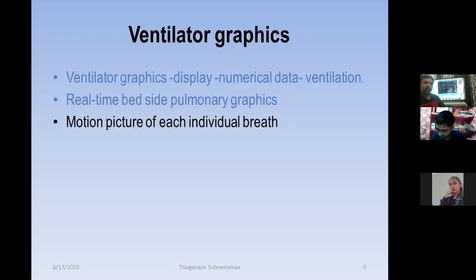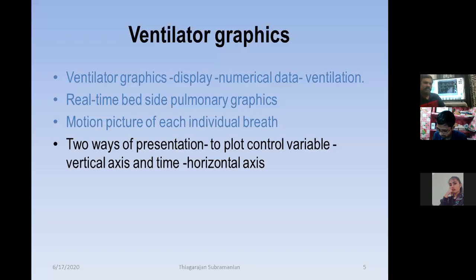Okay, these are the two loop graphs. So these are all the graph plots. Usually we see the loop graph as well as the scalar graph. These are the two major things we should always remember. I will explain that in detail in the next session. Slides.